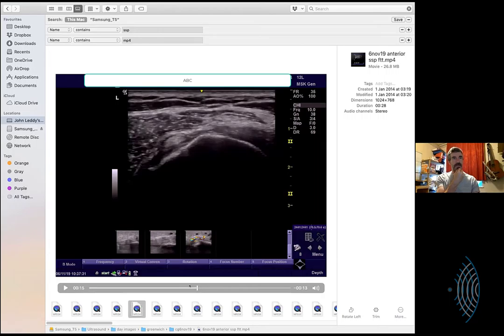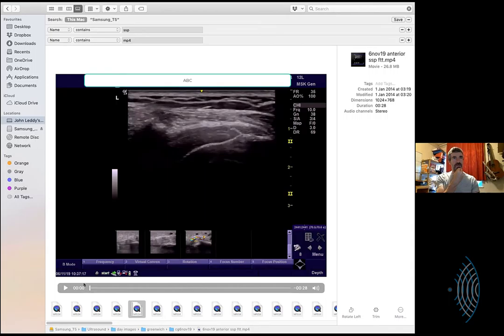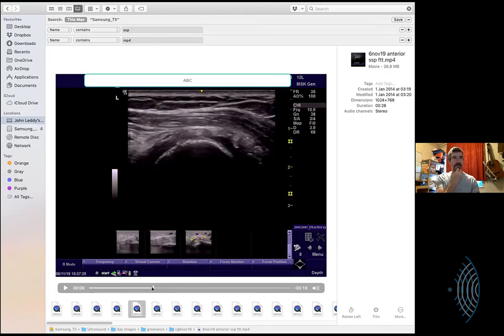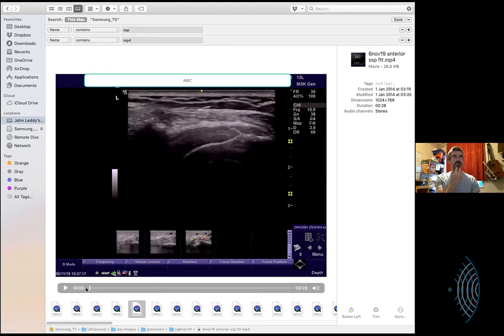But let's see. So long section, we're going from distal, from posterior to anterior, I think. So as we come through, there we see the biceps, no tendon there. So we bring the cursor back through this section. I would say supraspinatus. You're leafing through the most anterior supraspinatus fibers or the most medial supraspinatus fibers, looking for similar echo texture to the long head of the biceps, or you drop off that.